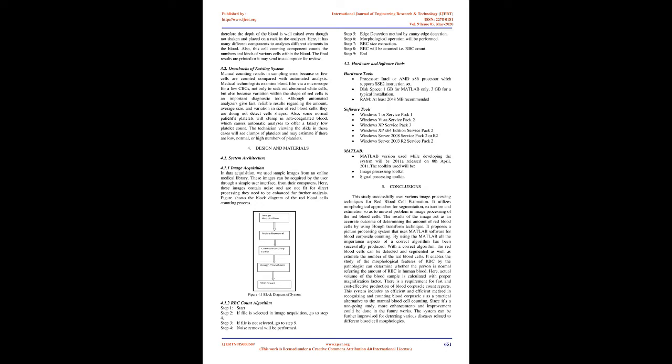The intensity is kept proportional, with the 256 scale of shade from black to white. The produced grayscale image must be enhanced by using contrast-limited adaptive histogram equalization, CLAHE. The morphological operation on the RBCs is intended for recognizing RBCs, before the number of cells is counted.